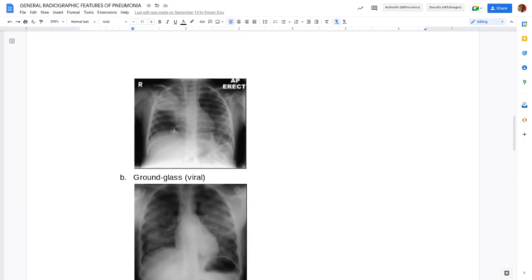And so the idea behind these AI models is that what's crucial is the quality of data that you have. All you have to do is feed the model with a lot of examples. You're just telling it, this is classical pneumonia, this is hospital pneumonia, classical pneumonia, hospital pneumonia, normal X-ray, this is tuberculosis.